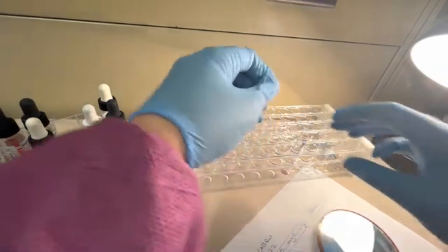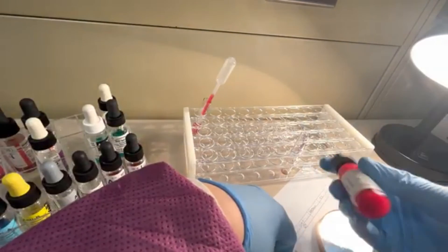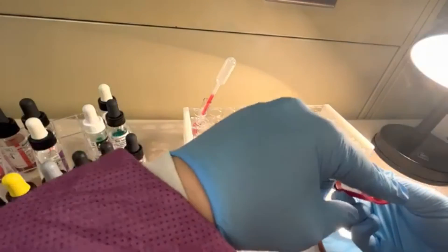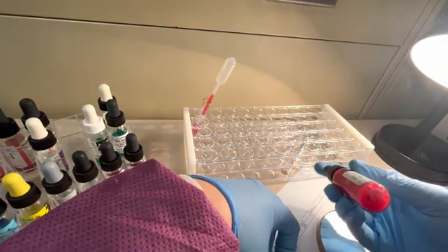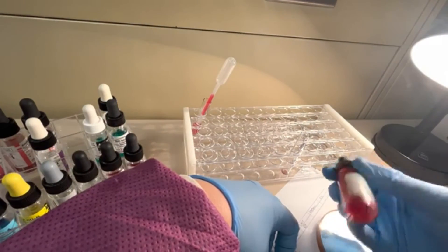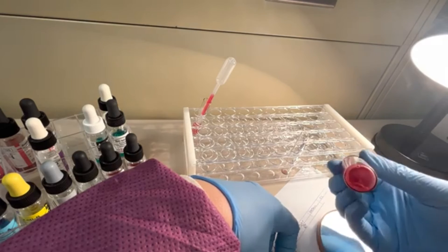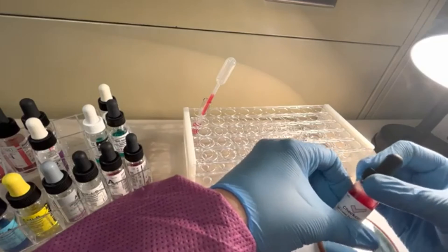We can't say that definitively yet until we do what? We have to add check cells to it. This is reagent. Always when you're using red cell reagent, make sure that you get all that red cell off the bottom of the vial. Check cells are IgG-coated red blood cells that are going to cause a positive reaction in any AHG. I'm going to put one drop in our negative DAT.